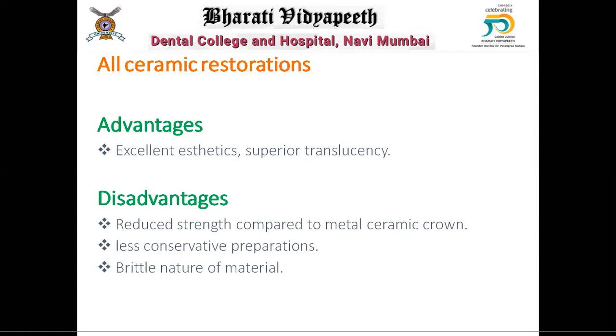Disadvantages: it has reduced strength compared to metal ceramic crowns. Earlier, we had to use alumina ceramics as core. Nowadays we are using zirconia as core, we have lithium disilicate, and those have better strength as compared to previous ones. Still, they are less strong than the metal ceramic crowns.